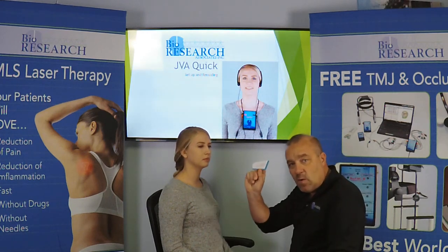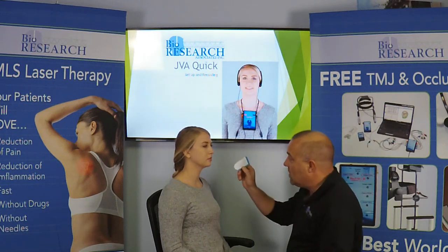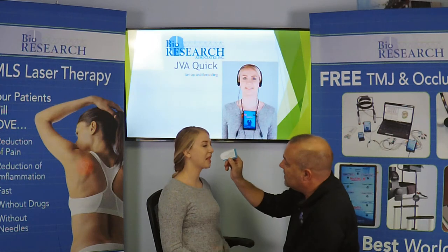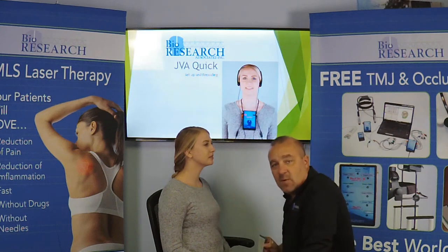To record joint vibration analysis, we click on the JVA Quick preset. The first thing that happens is we're asked, what is the patient's maximum opening distance? To do that, you can use a Boley gauge, but we have these range of motion cards that are available by calling BioResearch and ordering them. You simply put the notch in the lower teeth of the patient, have them open as wide as they can, wide, wide, wide. There we go, 62 is her maximum opening.